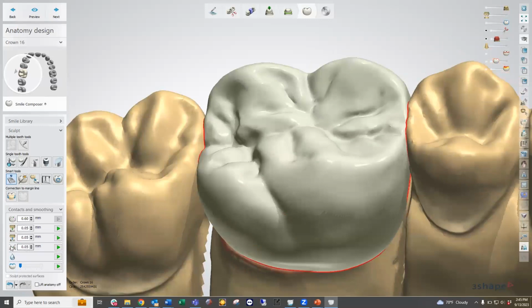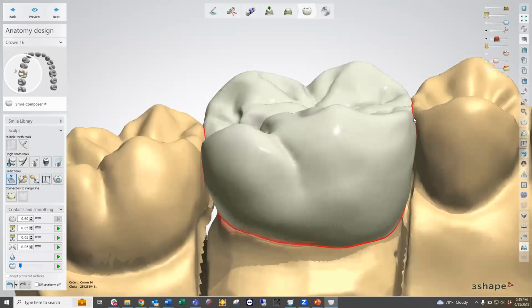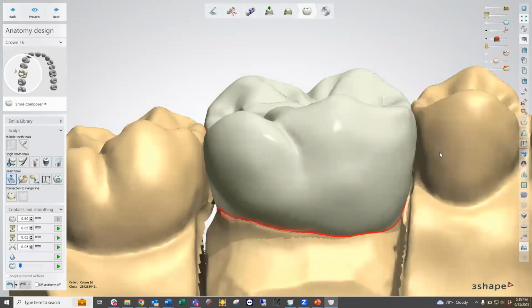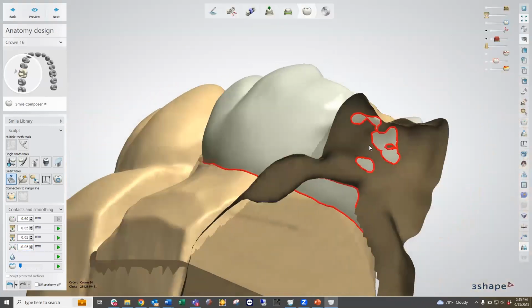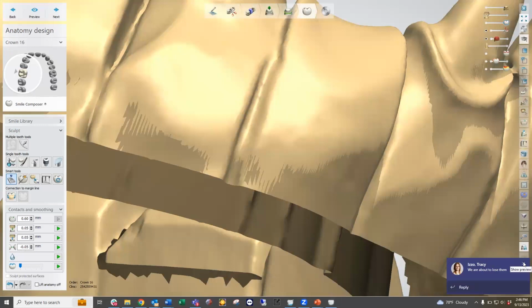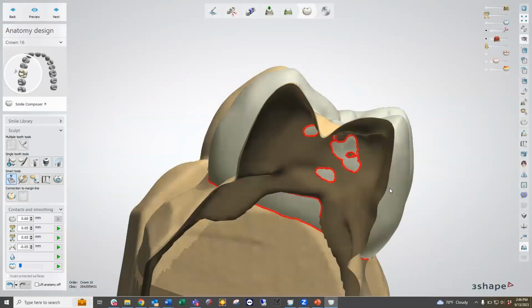And then we have an option that's going to be our desired distance to our neighbors, which is going to be our interproximal contacts. Typically, I like to go negative 0.05, and I hit the play button. And that will allow us to go ahead and take away all the material, but it actually leaves us into the contacts a little bit heavy by 50 microns. And this gives us a nice solidified area in that location.